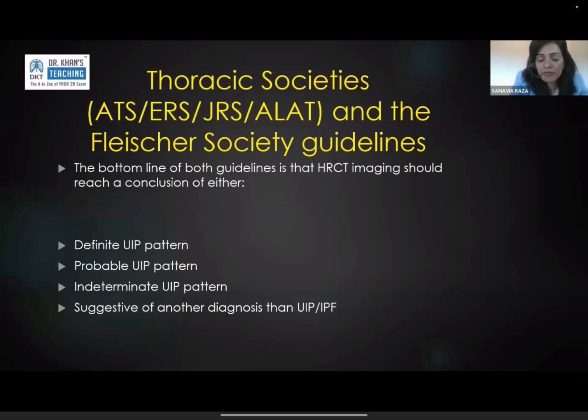And you can even have prone. So that's your initial assessment for ILD. Sometimes you can have a suspicion of HP come up from some other source. So the patient had a staging scan for some other reason, and the patient ended up with the ILD MDT saying, "Is this HP?" So the patient never had an expiratory scan. So the first step would be to get a small limited study, a limited interspaced expiratory scan, and when you can definitively call that as air trapping on the background of lungs that look like HP, you are pretty sure that that patient has chronic HP.